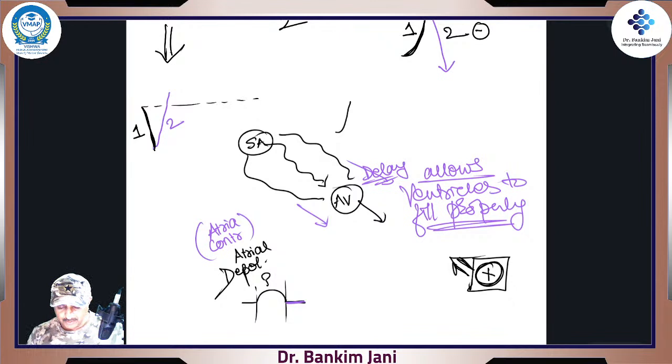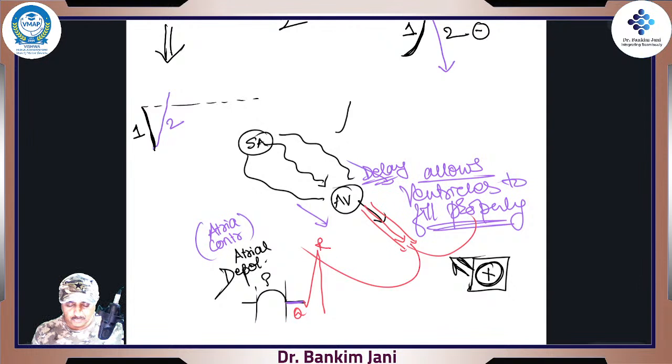And it goes. Now those ventricles, they are the big bosses. Thick musculature as compared to the poor atria. The atria are very small as compared to these big bosses, which have thick musculature. So that's the reason there is a big spike. This QRS is big.